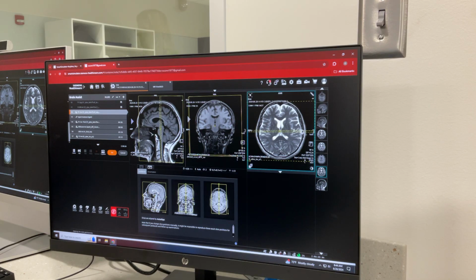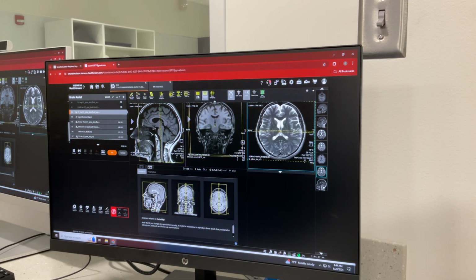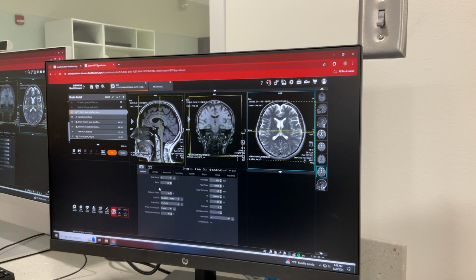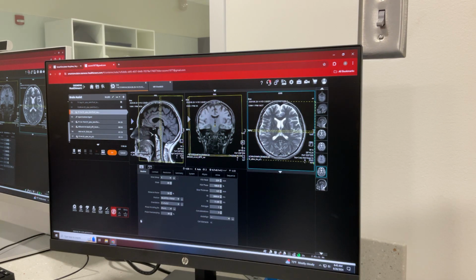Now go back to the right. So what's our phase direction on this coronal? Right to left. Okay, do we want it to go right to left? Yep, we do, so that's good. I'm looking at this field of view over here, that looks nice, we've got our phase going right to left.